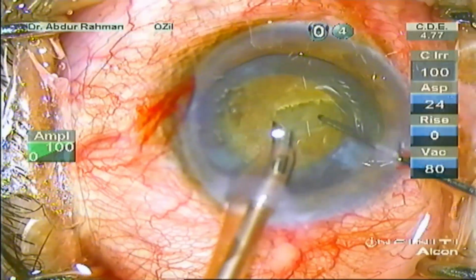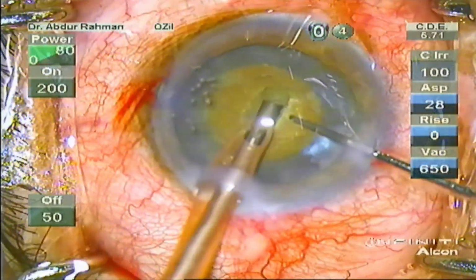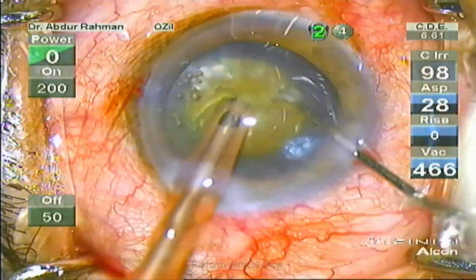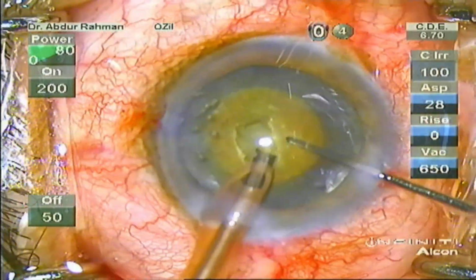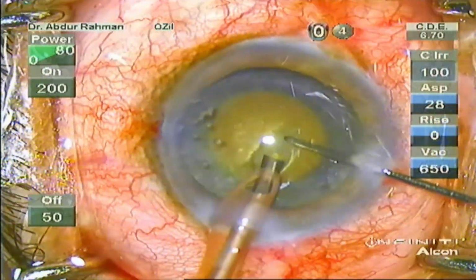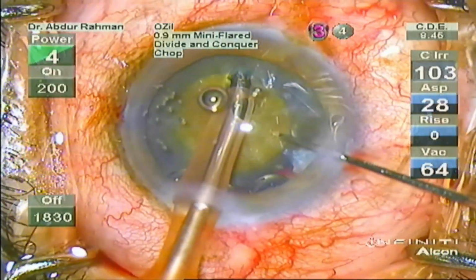The nucleus is highly mobile. Stabilize it with the second instrument. Now perform vertical chop. Now rotate the nucleus 180 degrees and propagate the chop to the other side.